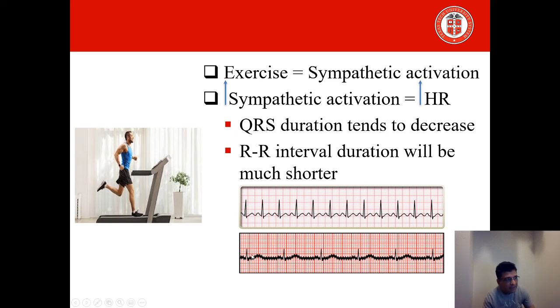You can see in the resting one, we have one big block, two big blocks, three big blocks, and approximately a fourth one. This one is not included, but if we include it here, we have a difference of 4 big blocks, or 5 fours are 20, so 5 times 4, we have 20 small squares between these two.